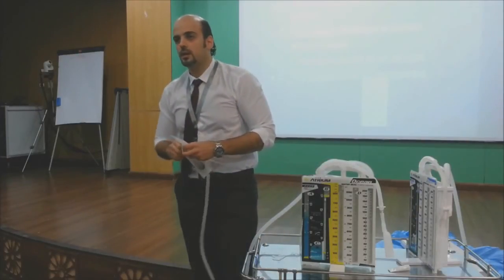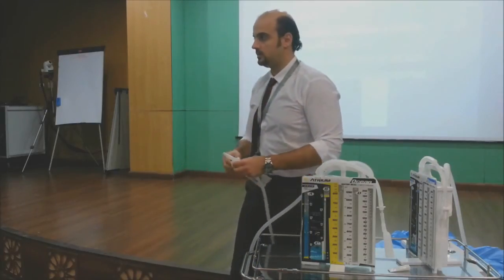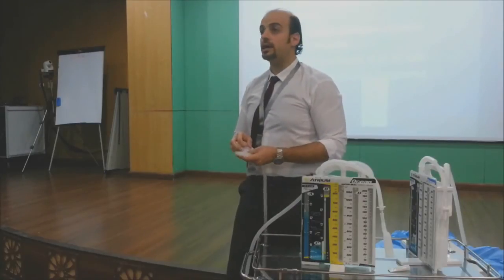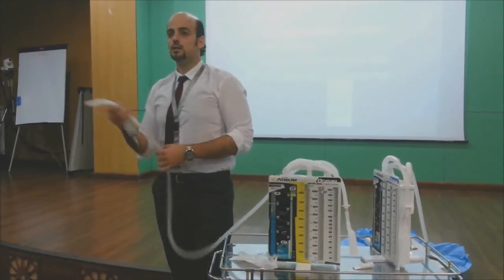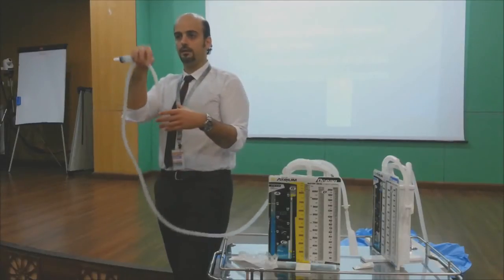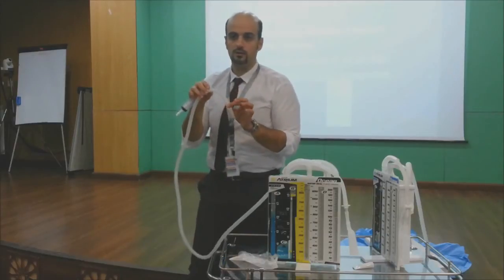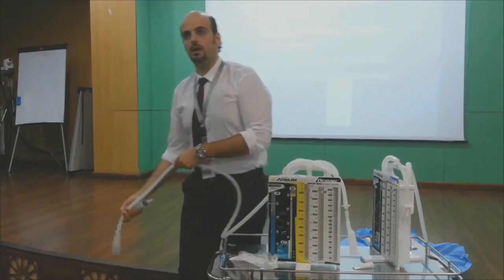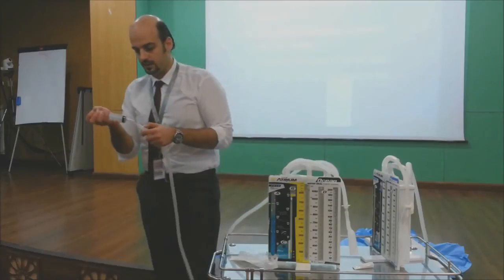Suppose you are at night shift and there is no underwater seal system, and this chest tube is broken. What will you do? And you cannot clamp. Why? Because there is a lot of air leak. Just disconnect the tube and put the tube in sterile water. It will work as a one-way valve for a very urgent situation. The air will come out and cannot come in because there is water. So this is a very easy principle.